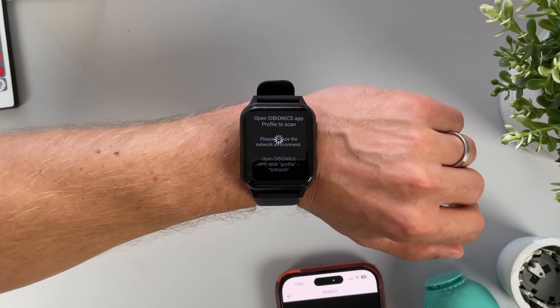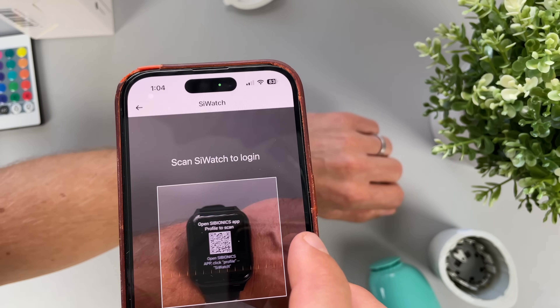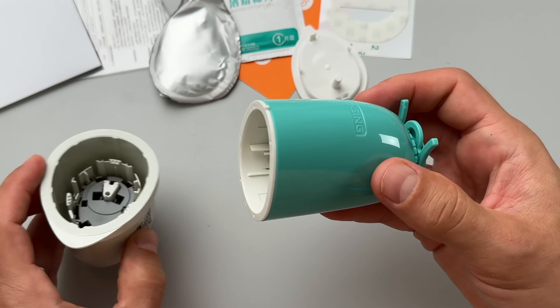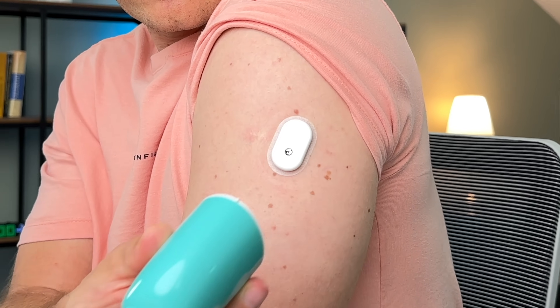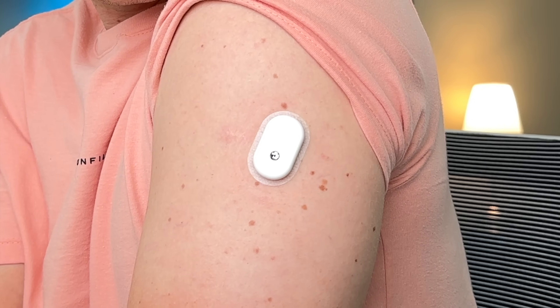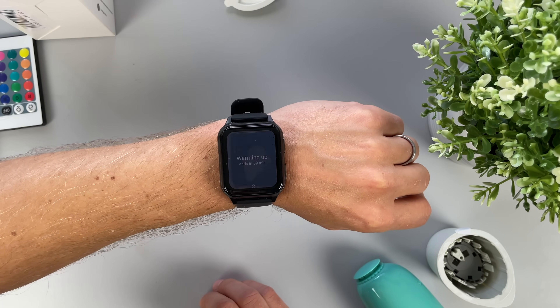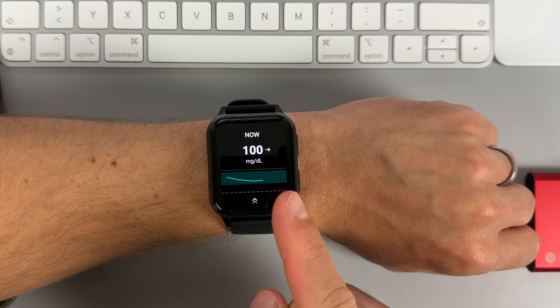To get started, I just had to link the smartwatch to the Cybionics CGM app by scanning a QR code on the watch screen with my phone. Next, I grabbed the CGM box, unpacked the sensor, and applied it on the back of my upper arm, just like any other traditional CGM. I connected the sensor directly to the Cywatch via Bluetooth, and once the 60-minute warm-up had passed, I received my first real-time glucose reading directly on the watch.